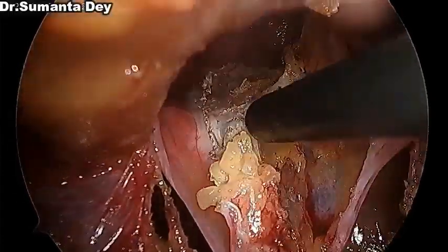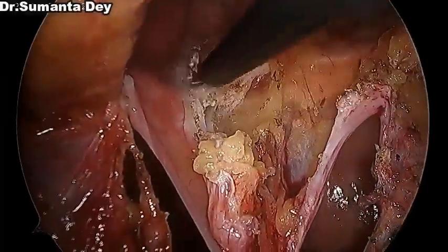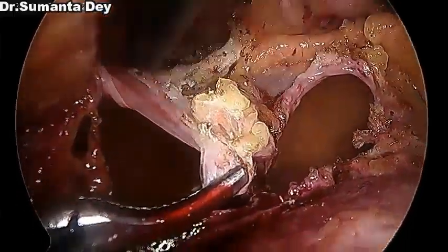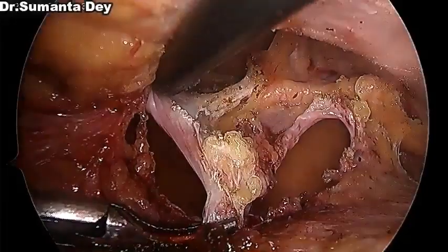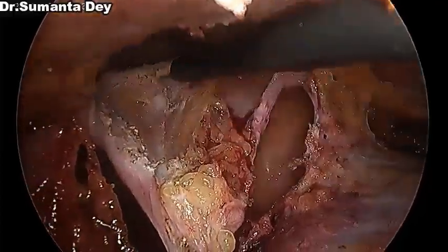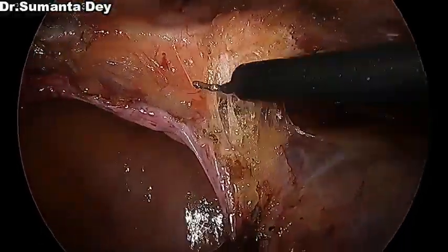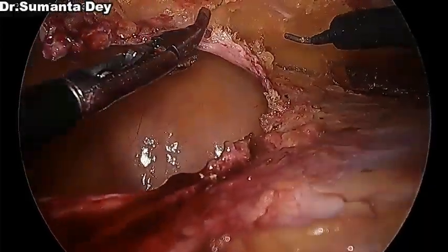Well, it is also true that the TAPP plus procedure is not possible for each and every case, and you should select your cases accordingly, according to the patient profile, the characteristics of the hernia, previous history of operation. So based on multiple factors, you should decide your choice of hernia repair for a particular patient. So case to case basis selection is very important.